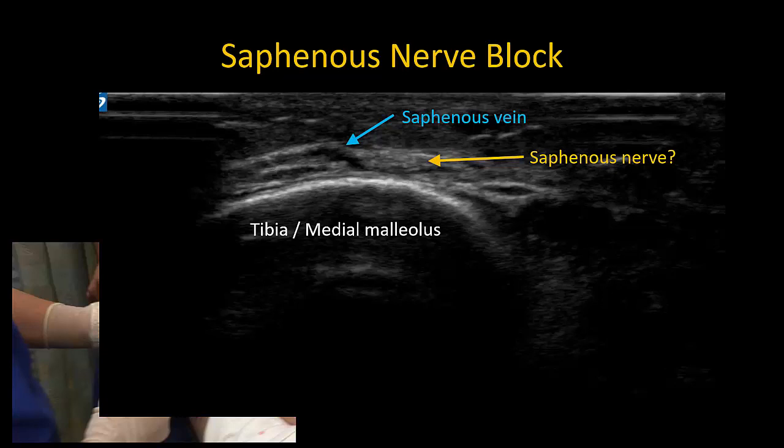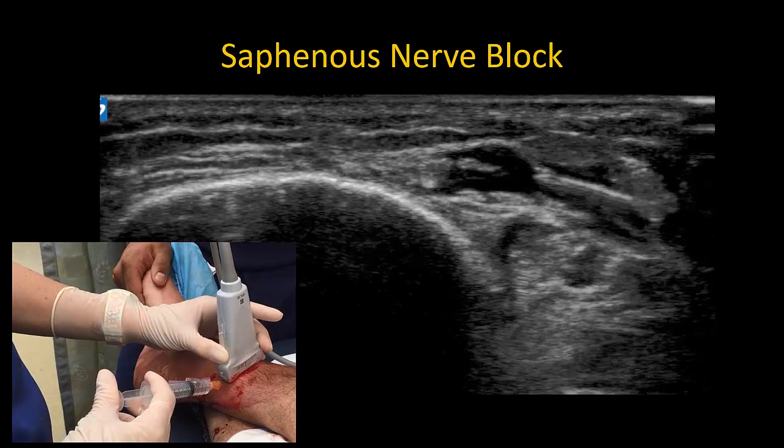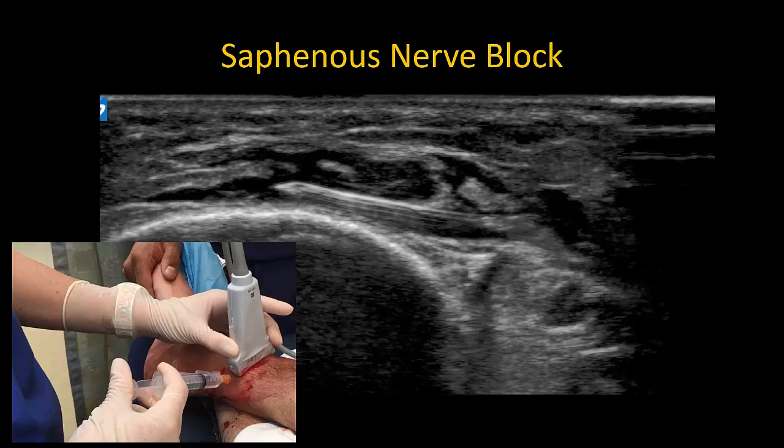The saphenous vein is easily compressed, so the probe must be held just lightly enough to obtain skin contact. A tourniquet is not usually needed, but it can help with vein distension and visualization. Insert a hypodermic needle into the correct subcutaneous layer, which is the same fascial plane that contains the vein. Inject a total of five mils to open up this plane with enough force to generate a jet of local anesthetic that pushes the nerve out of the path of the needle tip. Advance the needle tip while injecting to create a transverse wheel of local anesthetic on either side of the vein.